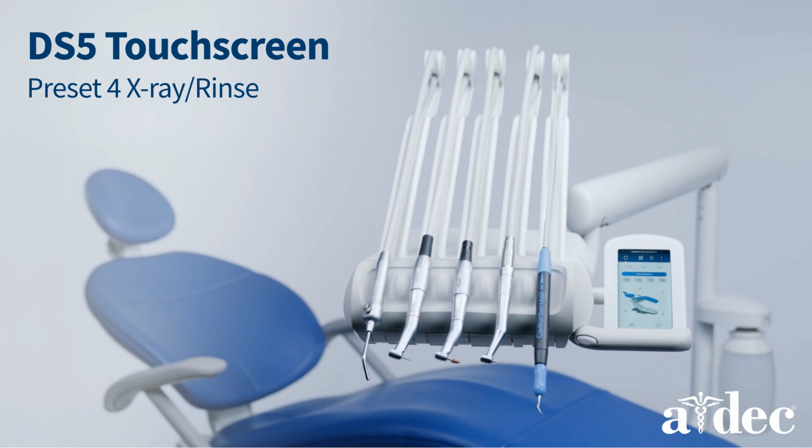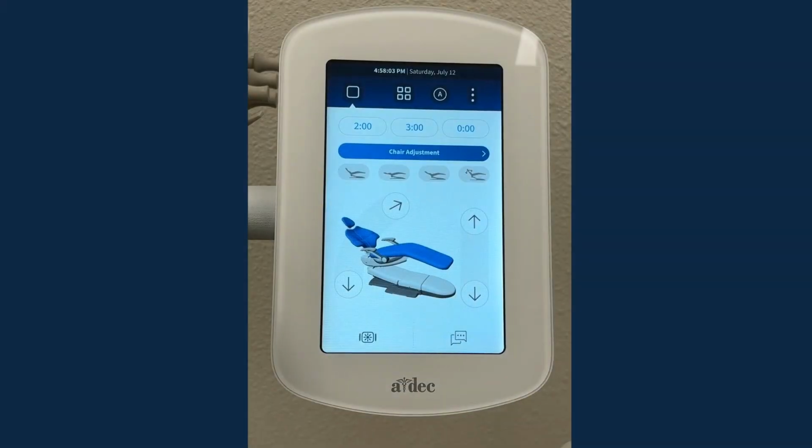In this video, we will discuss changing the fourth preset between X-ray rinse and standard preset functionality. You can tell the fourth preset is configured as X-ray rinse when the preset icon shows arrows on the chair backrest.